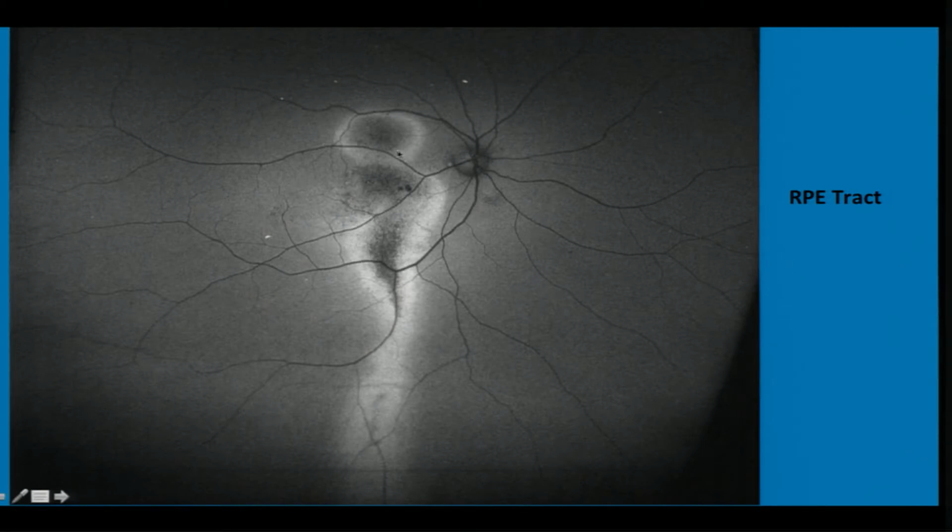This is again a patient of CSC. If you see carefully, we are all familiar. This is an RPE tract which is beautifully seen, and this is what I was showing: fire in the forest, central where it is dying, dead, and the periphery bright where it is about to die. So we know that RPE tracts are seen in CSC.